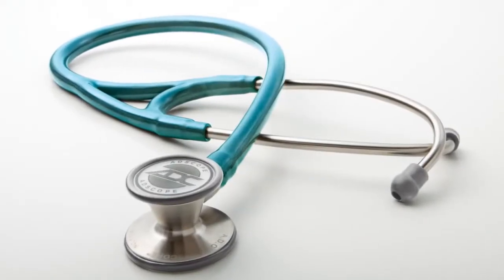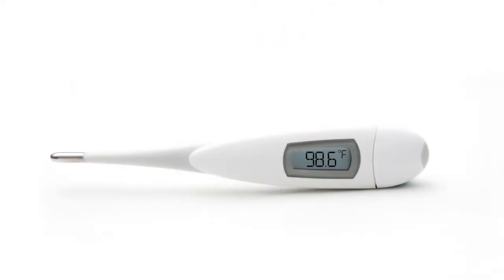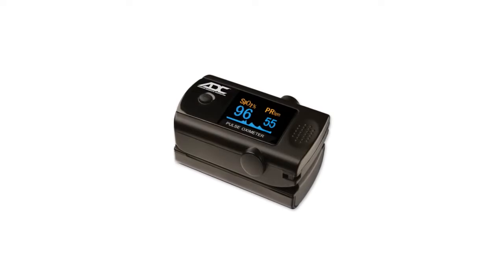ADC, a world leader in core diagnostic instruments, applied our innovative design approach and pricing sensibility to our line of fingertip pulse oximeters.